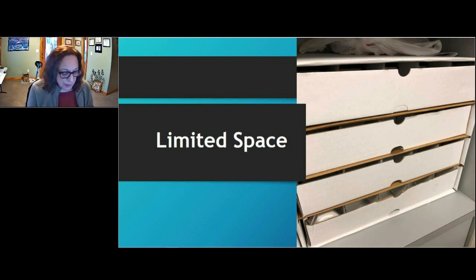Because if the peel pouches or the wrapper around your cassettes is torn, smushed, for lack of a better word, compressed, then you could potentially have micro tears and introduce organisms into those packages. So storage is a very important part of all this workflow design.